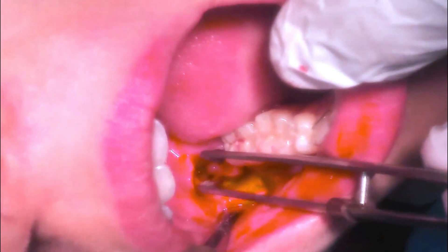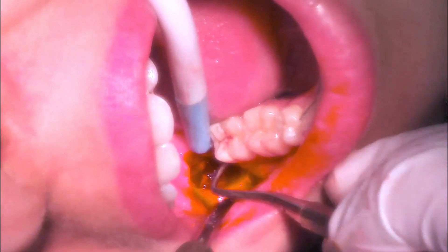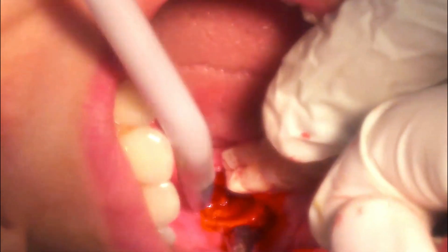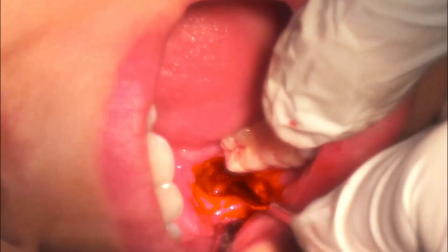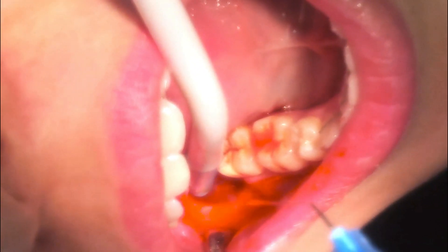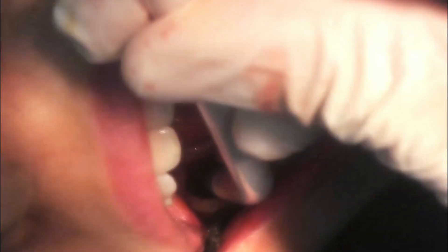After this, it is important to nicely curette the socket and remove any granulation tissue. I use a bone file to smoothen any sharp bone pieces, and then a betadine solution mixed with water is used to flush out any debris which may be left inside.